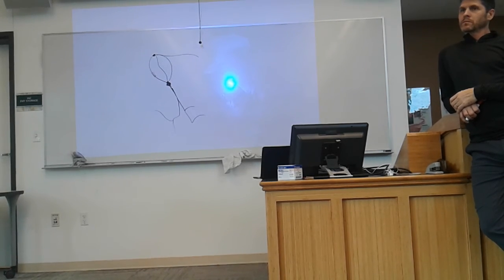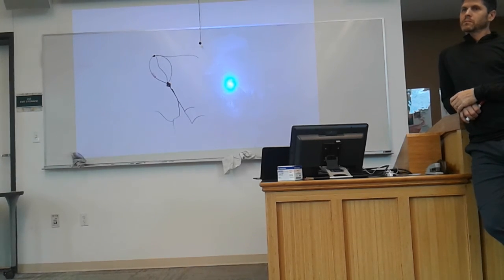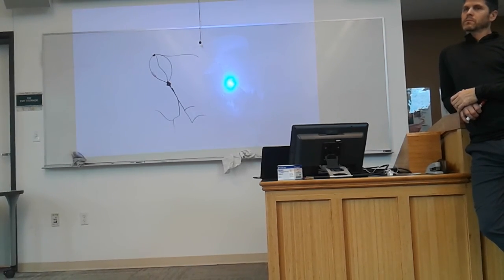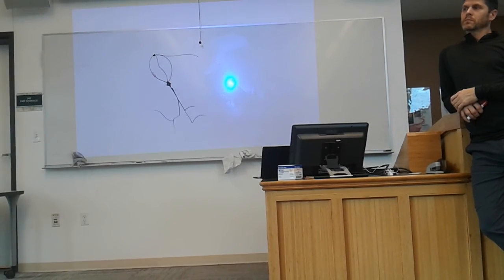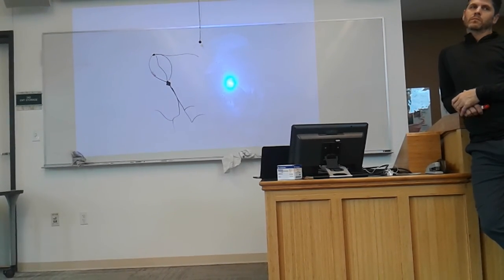I would agree with that. As normal would, because you have a whole section of the heart that's having a delayed reaction to the electricity, so that's why you have a notch. Why wouldn't that just delay your PR segment? I don't think it would delay it because then the rest.